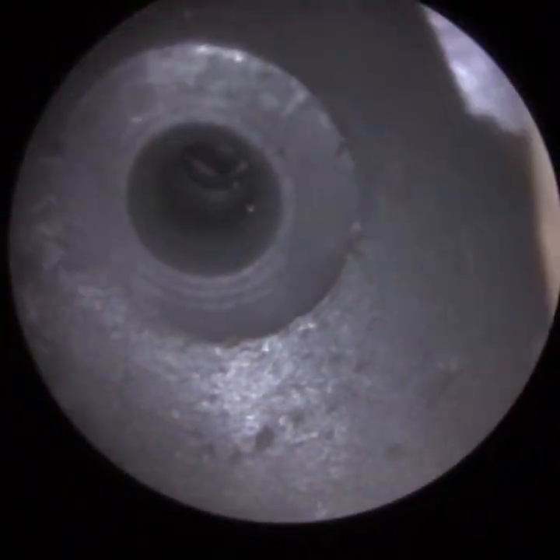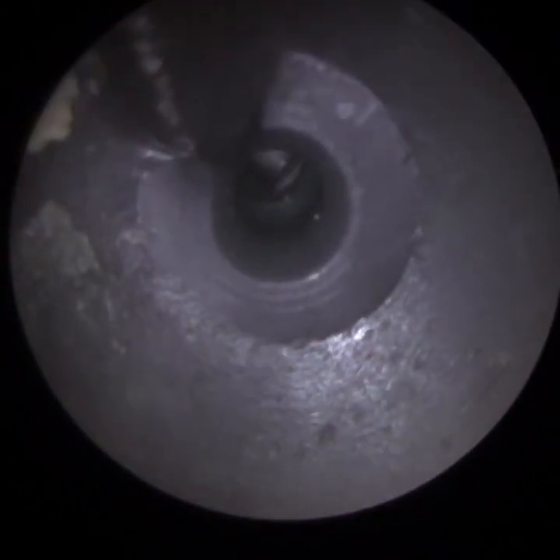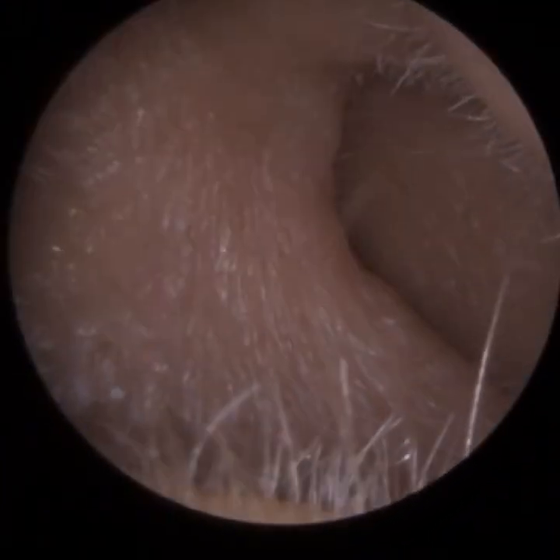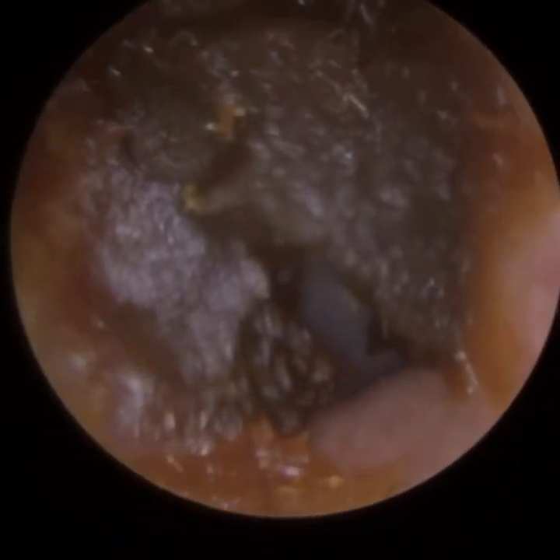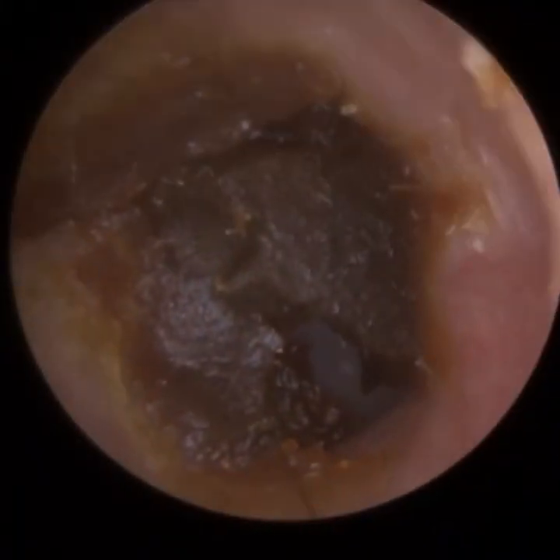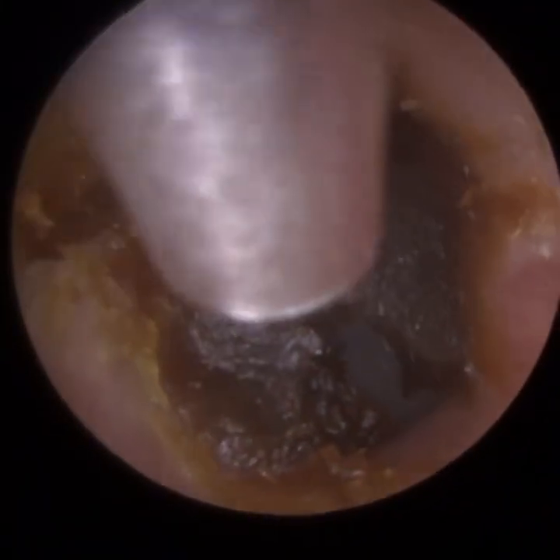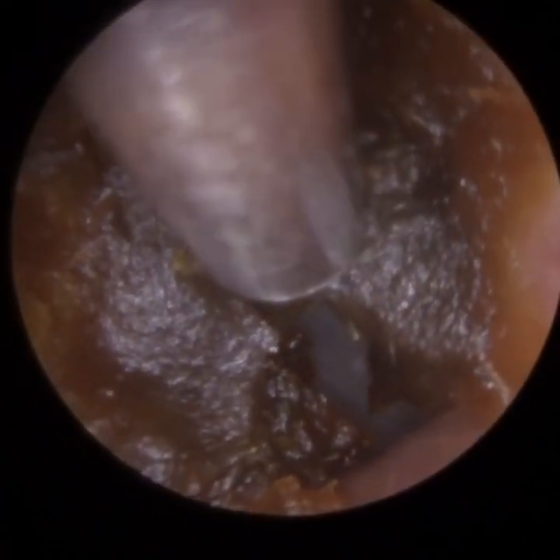They are a hearing aid client, and unfortunately the dome — the earpiece that attaches to the end of the hearing aid — got lodged in the ear. The client took full responsibility because they were using, across many different hearing aid manufacturers, each manufacturer has a different dome that fits only their hearing aid, and they used an old hearing aid dome on their new hearing aid. So it wasn't securely attached and when the patient attempted to remove it, it got lodged.